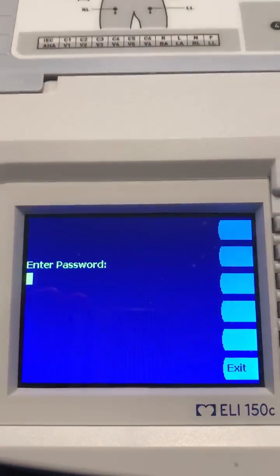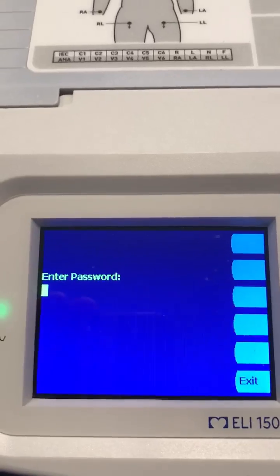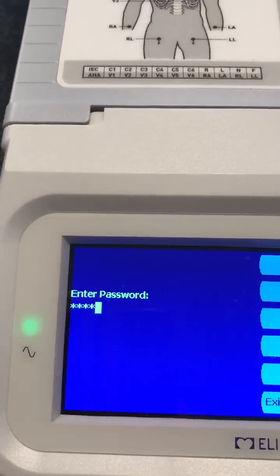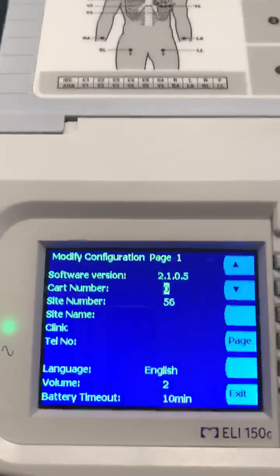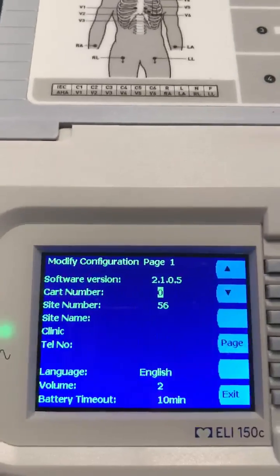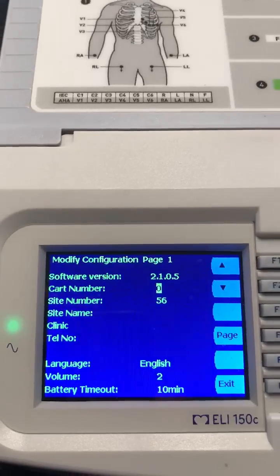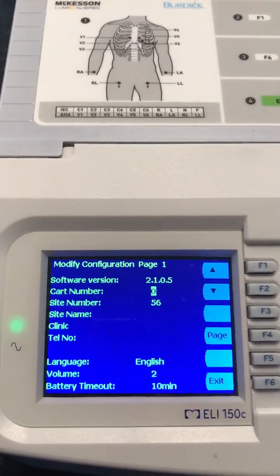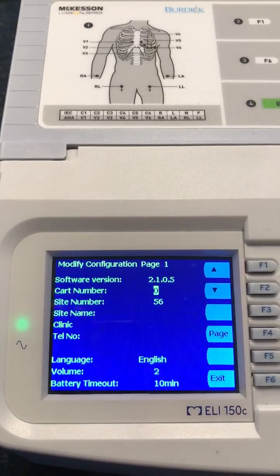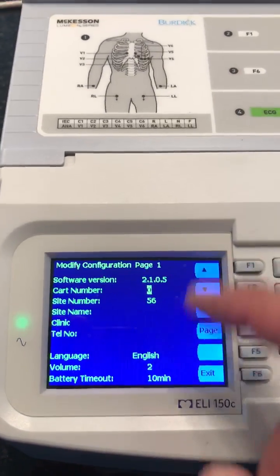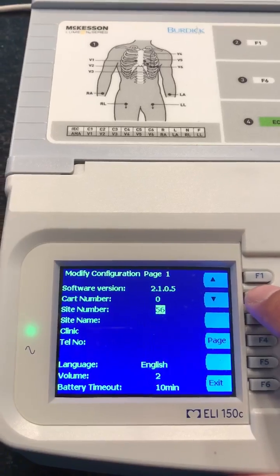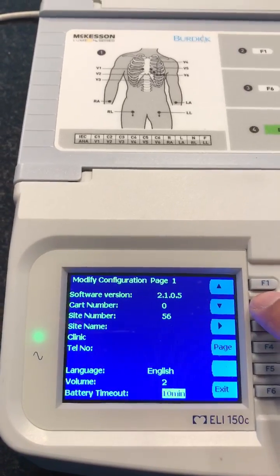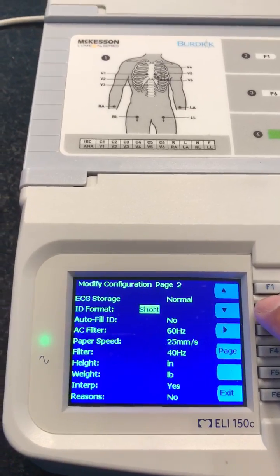It says 'Enter Password,' and I type in 'admin' — A-D-M-I-N — just like that. It then goes right into the configuration page.